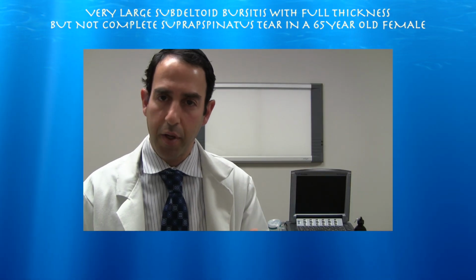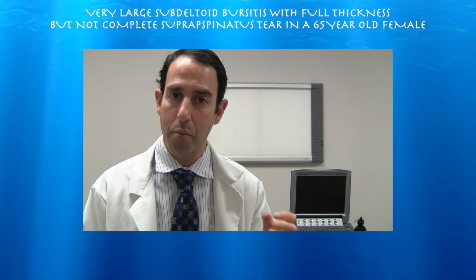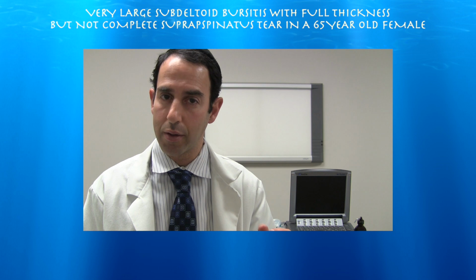This is a 65-year-old female with pain in her left shoulder. Unfortunately, she was sitting on the toilet seat and somehow banged it against the wall and came here with tremendous pain. She had minimal active motion. Unable to get an MRI because she has a coil inside her brain.